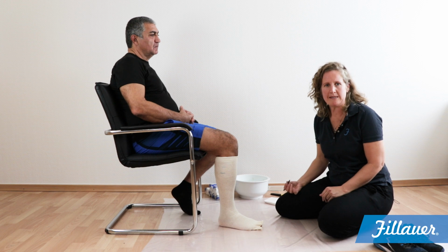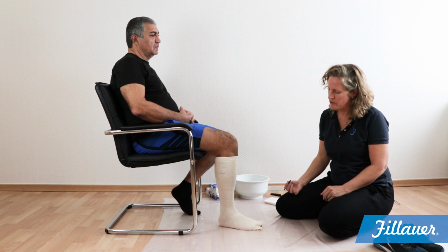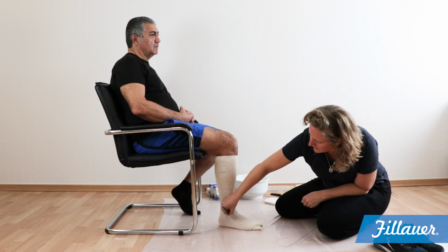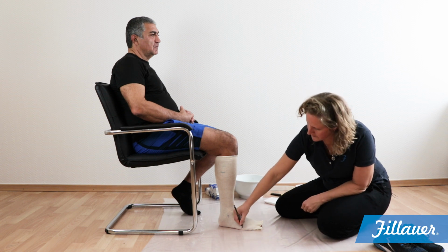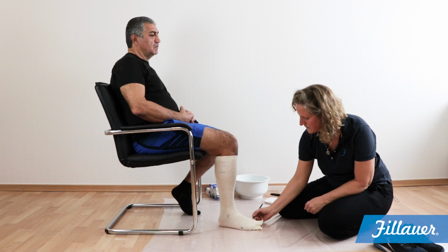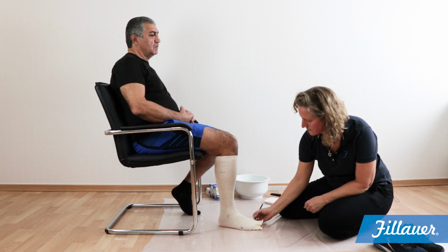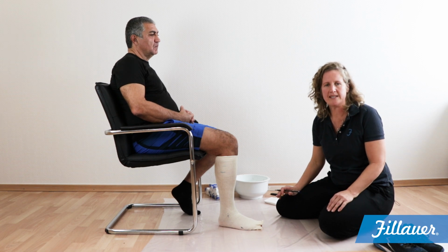Sometimes bony prominences are not always visible on the cast, so this is why we want you to mark the malleoli, the fifth metatarsal head, and the first metatarsal head. You can also mark if there are any other sensitive areas which you want us to consider when we design the brace.